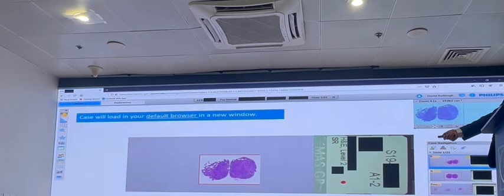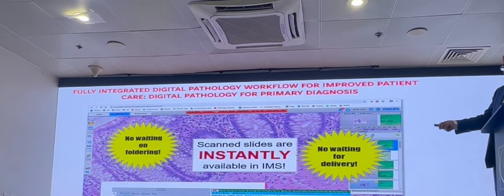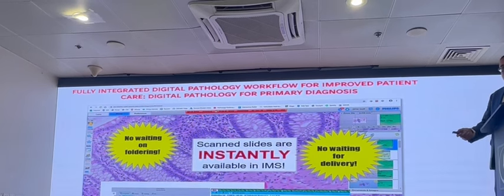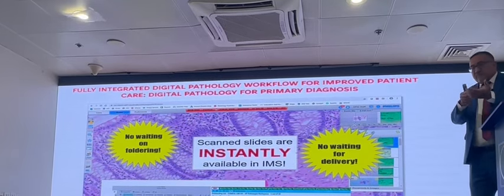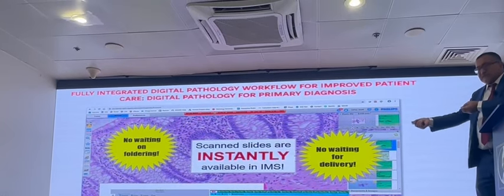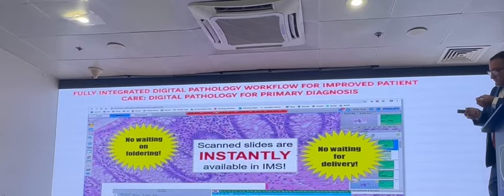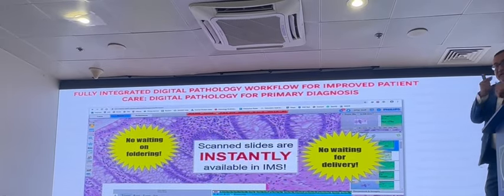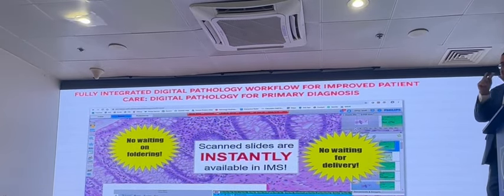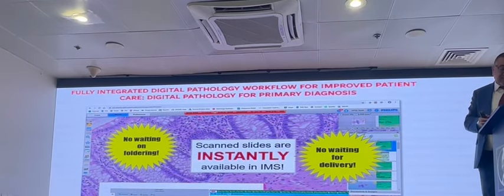I can go up and down, and all of these are without order, right? So they're based on the barcode. So the histotech doesn't have to match the slides with every case. All they do is put the slides as they come out of this auto stainer, put them directly into the machine. They have a barcode which puts it with the right case. So it saves a lot of time of cataloging cases.